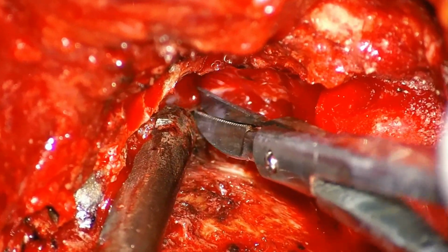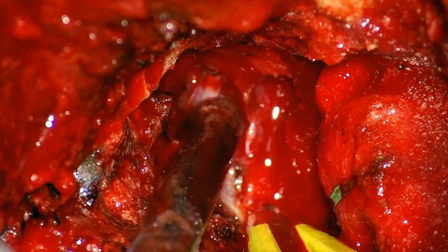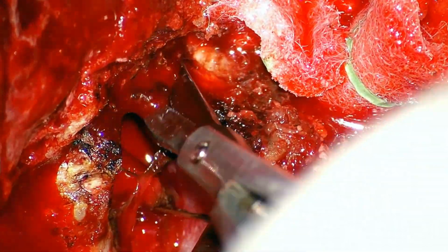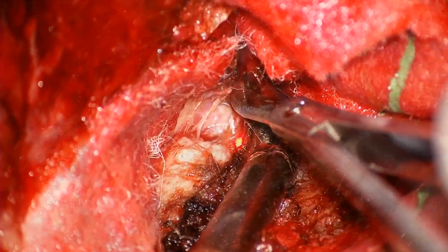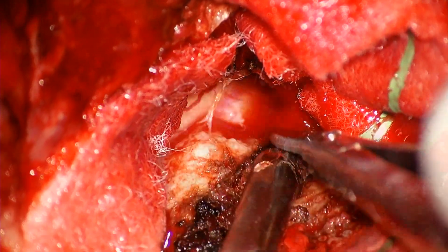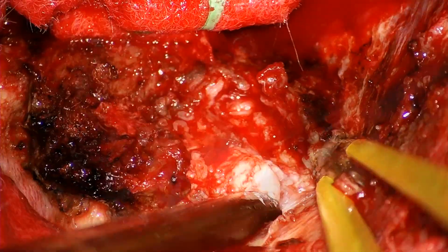Once we work through the posterior temporal margin of the tumor, we expand our anterior cut over the tip of the temporal dura, and we connect with the epidural space that we delineated during the peeling of the middle fossa. Because of the middle fossa peeling, we have been able to devascularize also the medial margin of the tumor, as we said previously. See how this previously skull-base meningioma we transform into a convexity meningioma, in which we have access to all its margins to achieve devascularization of the tumor.